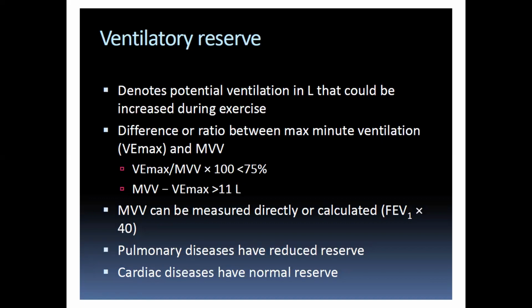And so if I stop exercising, it will always be because of a cardiac limitation. Normal people stop exercising because of cardiac limitation, not because of pulmonary limitation. So at whatever the maximum normal people can give, they will still have a breathing reserve of at least 20%, but ideally 30%. Does that make sense? In cardiac limitation, your heart will limit you before your lungs. Your breathing reserve will be 30% or more, and definitely not less than 20%. 20 to 30% is that gray zone area. So it's a very important number.